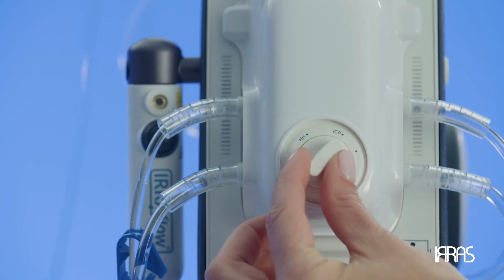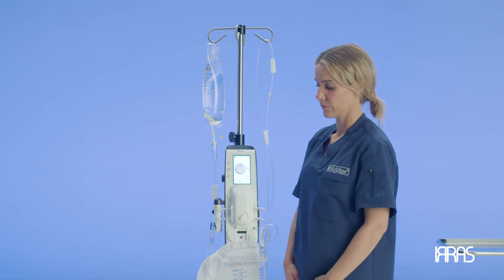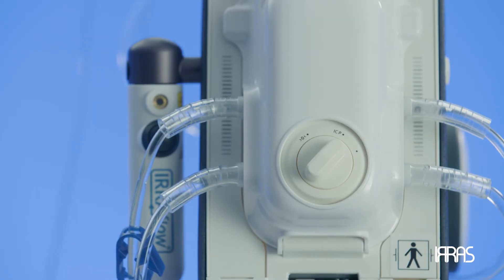When returning the cassette knob back to the starting position, pay special attention to turn the cassette knob all the way clockwise until it will not turn anymore.